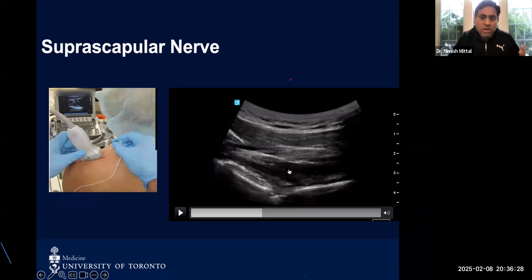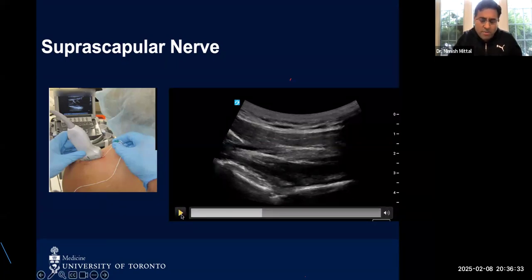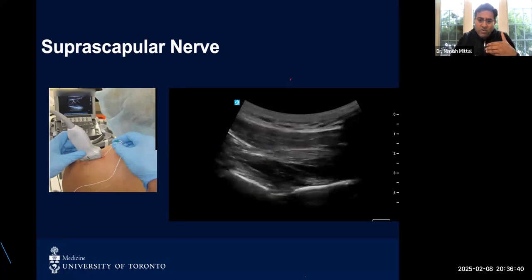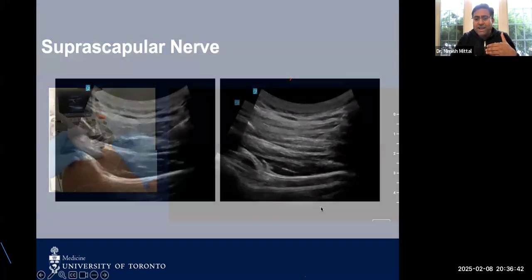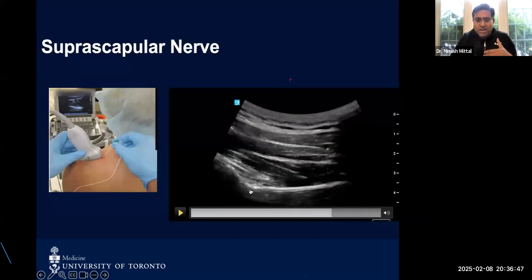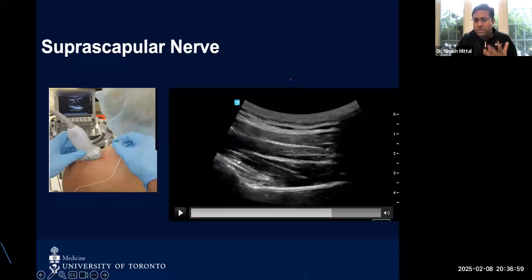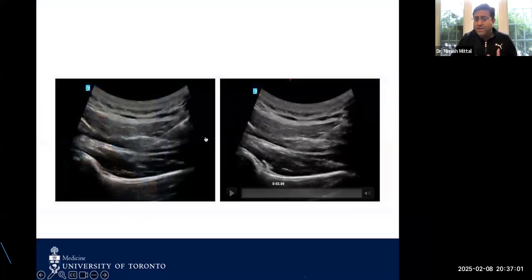If you go around here, you can cause a pneumothorax, or you can puncture the lung or go into a bad zone. You don't want to do that. What we do after going here is that you again start translating the probe posteriorly or backwards, and then you start coming to a place where you would again see the entire body of scapula. As soon as you start drifting posteriorly or downwards and you see the entire bone of scapula, that is where you should be making this injection for the diagnostic block.